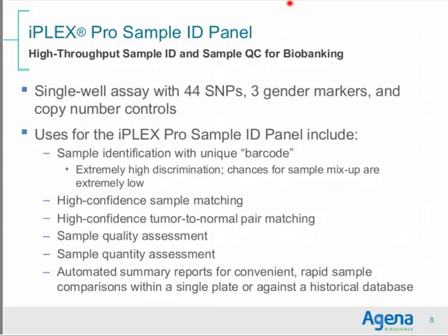I think everyone will recognise that if you could be any genotype in your tumour, there is very little power in that matching. Now, with 44 SNPs, high minor allele frequency, 22 of these will be heterozygous on average in any individual's germline. Now, we exclude those because they give us no power for matching. So that leaves us with 22 homozygous SNPs, and one of the things that does not occur in tumours is a gain of an allele generally, particularly with the markers that we're using here. A gain of allele is not expected, so we have 22 homozygote assays which we can use for high confidence matching, still giving us 10 to the 9 power of discrimination.